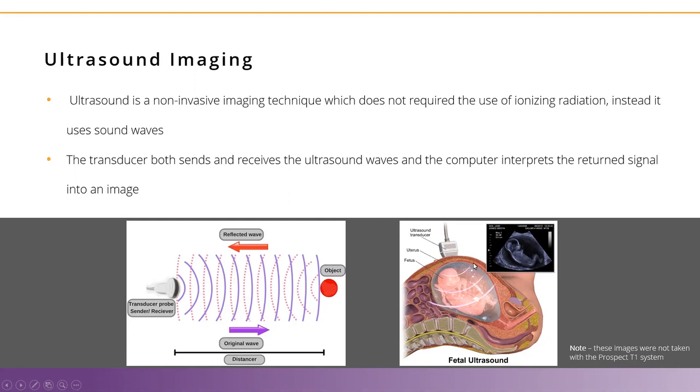And the probe is simply moved over top of the skin to look and identify the different anatomical targets. The same applies to the preclinical world. The hair is removed from the animal, the probe is placed on the skin in contact with the ultrasound gel to allow the sound waves to be transmitted, and we get an image of the anatomy below.